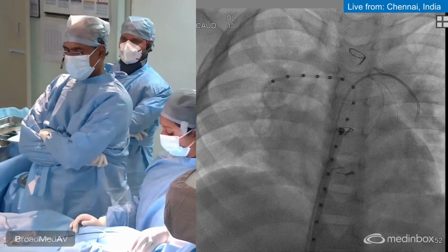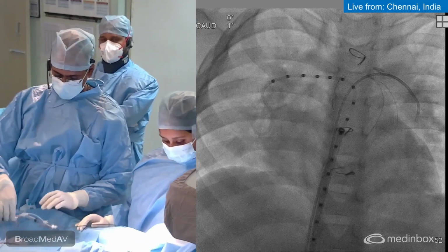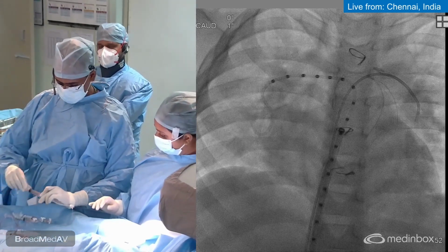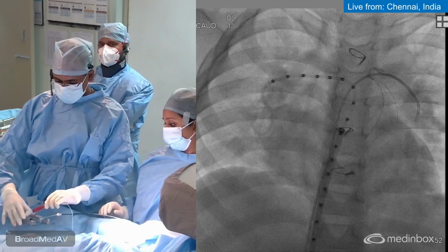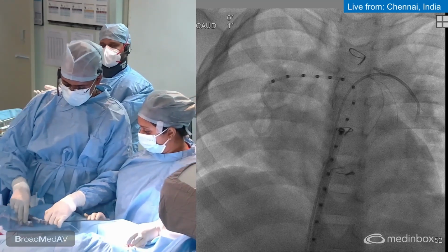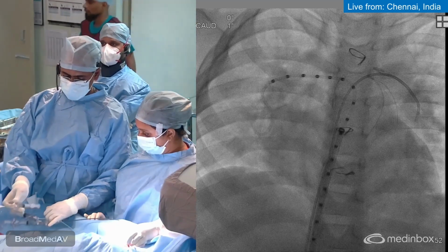So some basic questions to discuss, sir. Yes. So you explained like you are taking two venous accesses for facilitating bilateral PA stenting. So what will be the problem if only one of the branch PA is stented and the other is addressed after stenting, like recross again the other artery and stenting again? Can be addressed that way also.